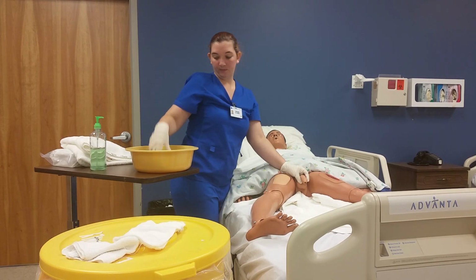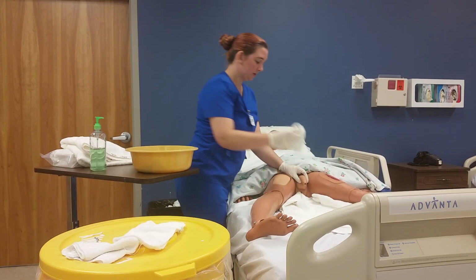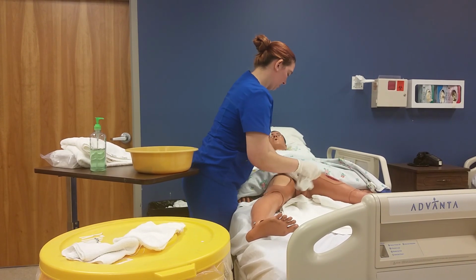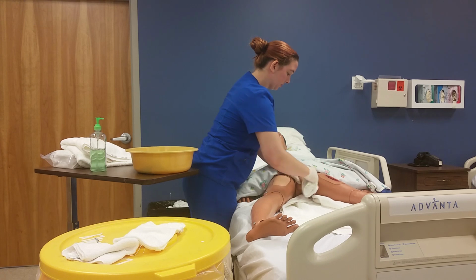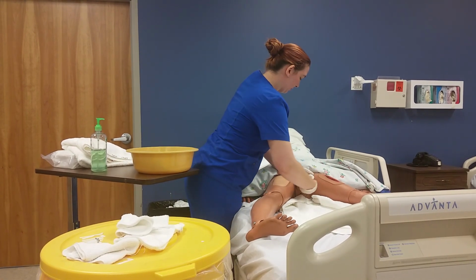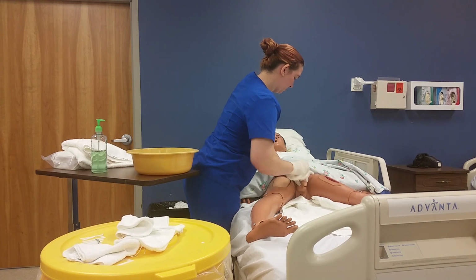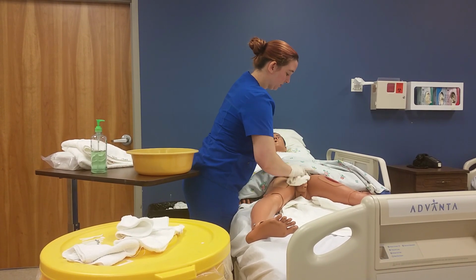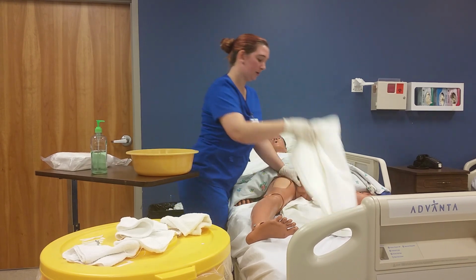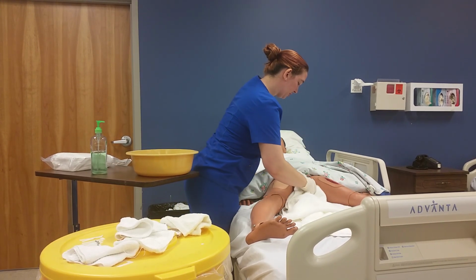I'm going to get rid of that one. I'm going to do this one. And do it again. Get rid of those. Do this one. Get rid of those. I'm going to take my towel here and I'm going to just dry them off.